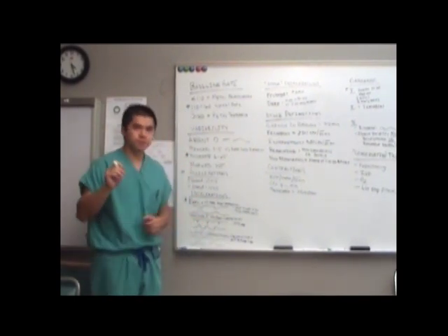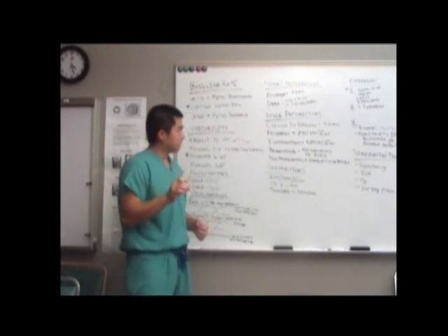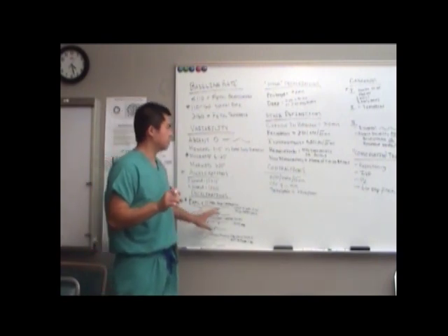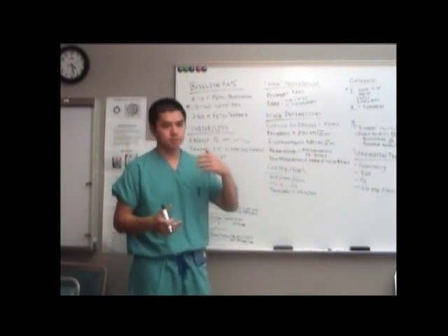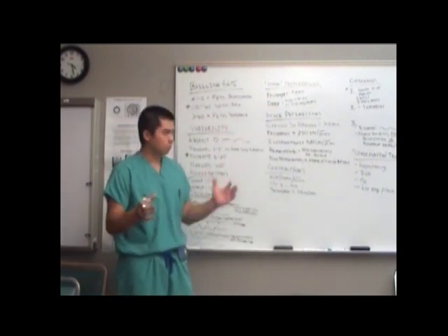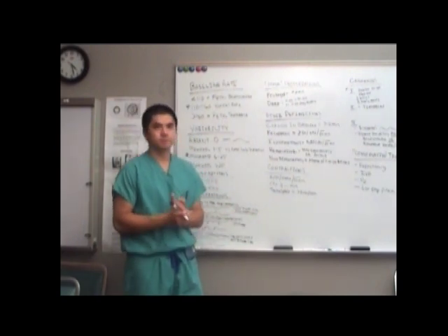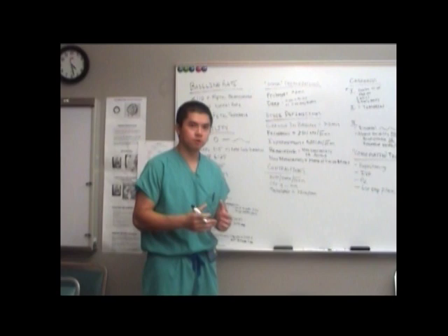But you as the physician who is taking care of the patient, anytime you have changes in your fetal heart tones that you need to address, when you go in to the room to see the patient, what's the first thing you need to do? Nope, not oxygen, not IV fluids, not repositioning. You check the patient.